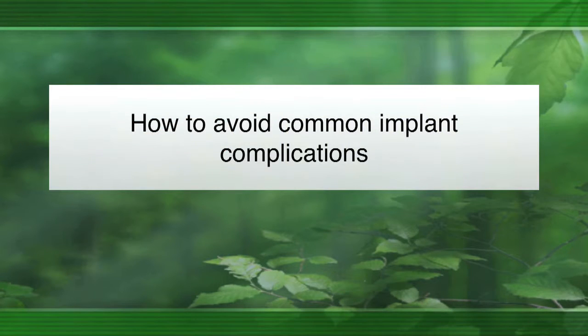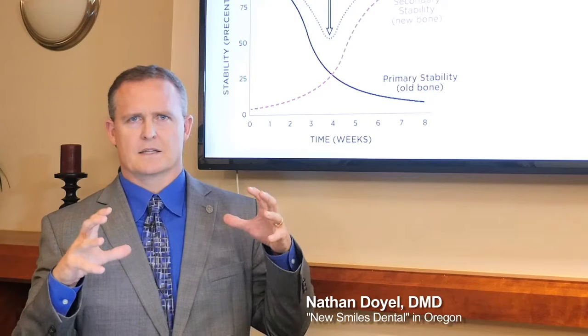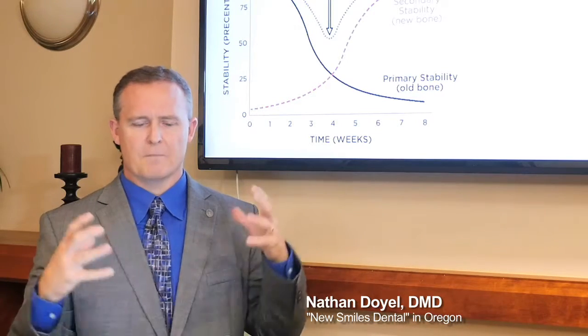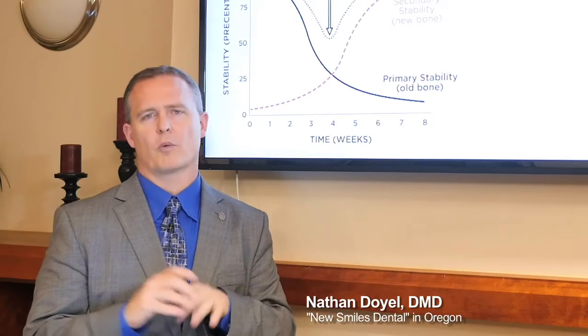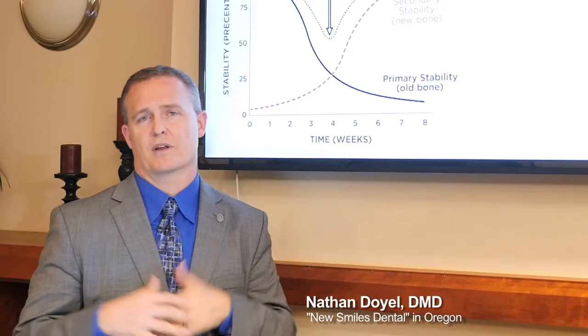So, how to avoid common implant complications. One of the things you've got to remember is that during the implant healing process, there's a time where osteoclasts begin to break down the bone, and that time has a dip in the stability of the implant. You have initial stability when you place the implant, you might have 60 newtons of solid stability, but then as the body begins to heal, it breaks down the bone with osteoclasts before it builds it back up. That dip happens about 3 to 4 weeks, maybe 6 weeks in there. The implant is more at jeopardy at that time.